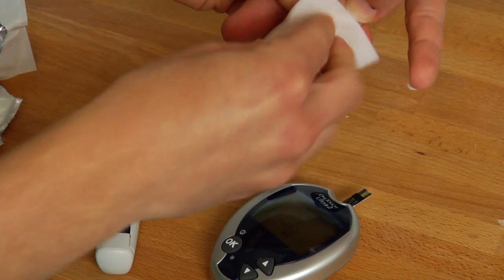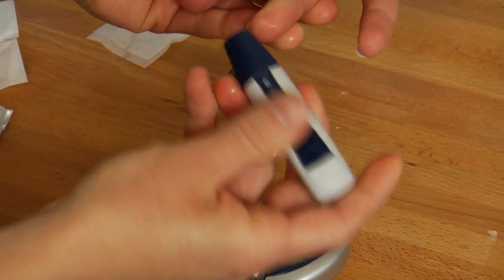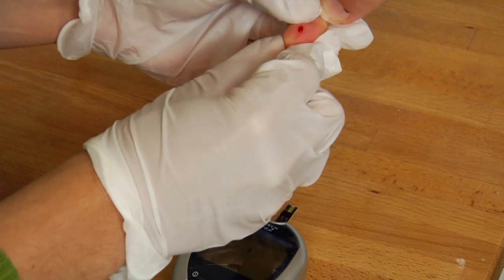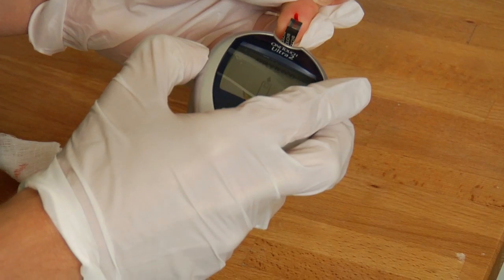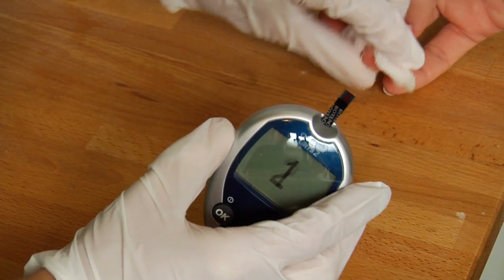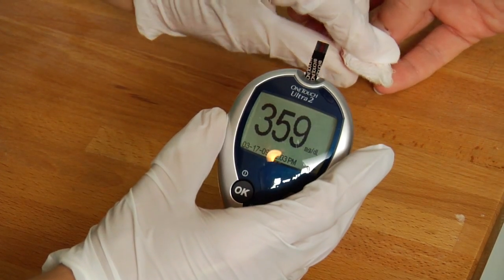First, you're going to wipe off your finger with alcohol, use the plunger, and draw blood with that. Then you're going to wipe away the first drop of blood and gently squeeze the finger again. Using the test strip that you've already made sure matched with the monitor — that it's reading correctly — and that's already inserted into your monitor, you're going to put the droplet of blood into the correct place on that test strip.